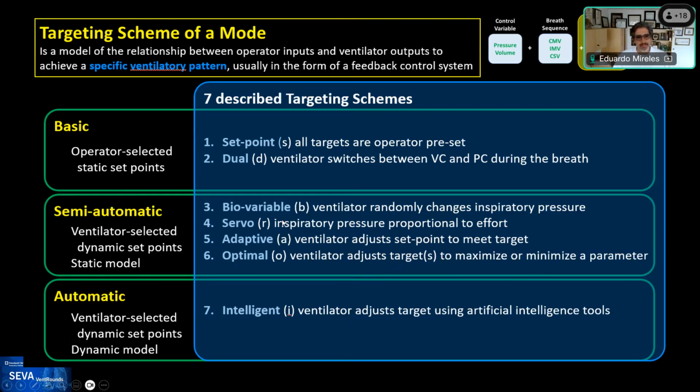And actually, we don't really know. I mean, we've talked about pressing the button for adaptive tube compensation. Practically on any mode on some ventilators, you can activate it even in volume control. And the rationale for doing that is still unclear to me. It seems more like an option that was available from the engineering standpoint, but not necessarily from the clinical or physiological standpoint. Rob?